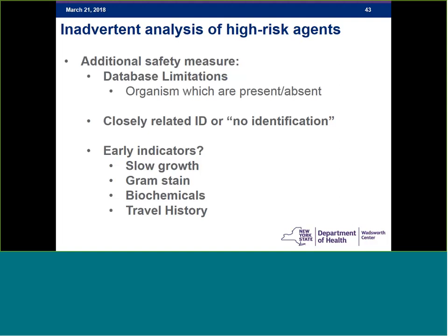This makes it all that more important to review information that is available about the specimen, such as patient travel history, growth rate, gram stain, and biochemical results.